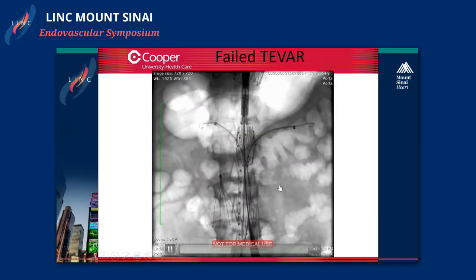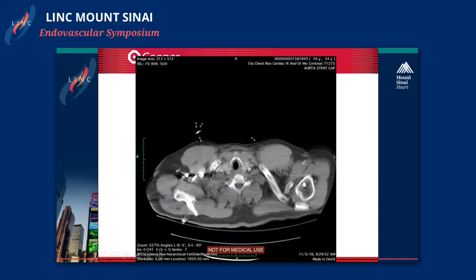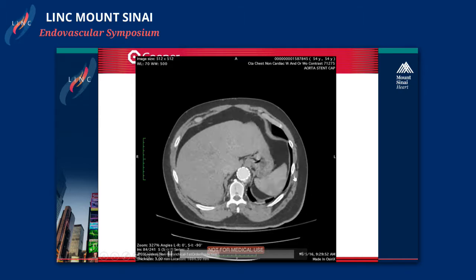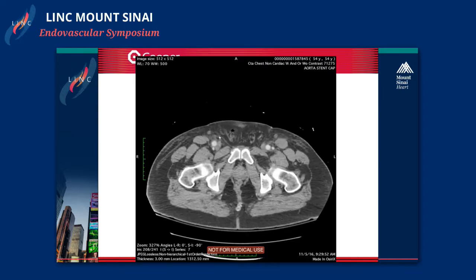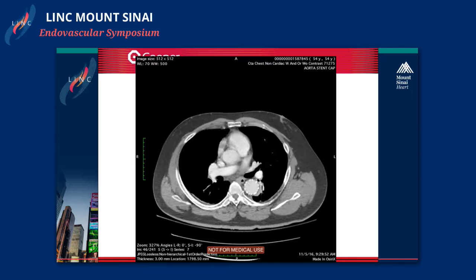Well, I could show you. I really want to show you. Here it is, as a CAT scan, you see that endograft. It's got a little bit of flow in the false lumen adjacent to the celiac, and that's because we didn't cover a big area in that celiac. There's still a small reentry tear.